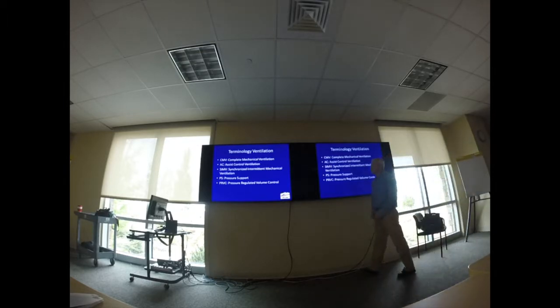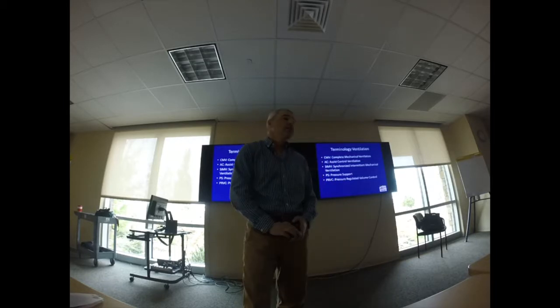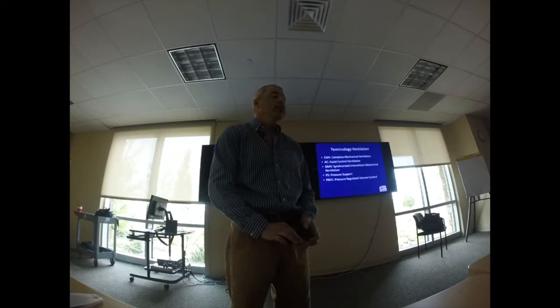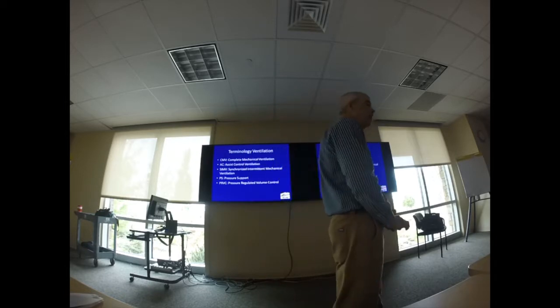We do see assist control, and assist control is the closest thing that we have available today to complete mechanical ventilation. So here's what assist control mode of ventilation does. I set a rate.